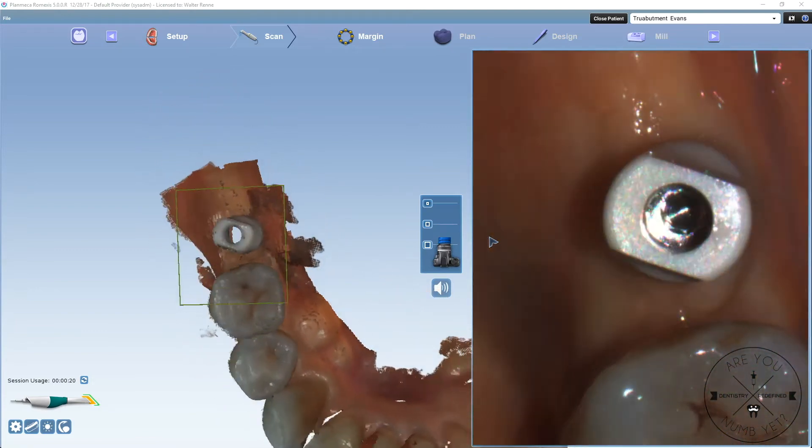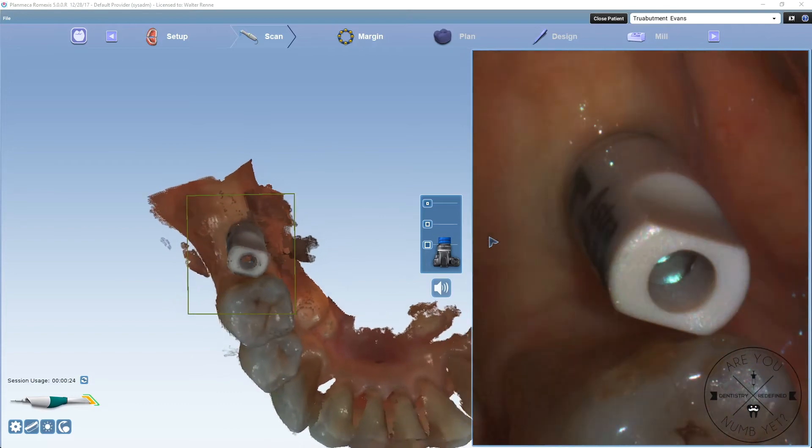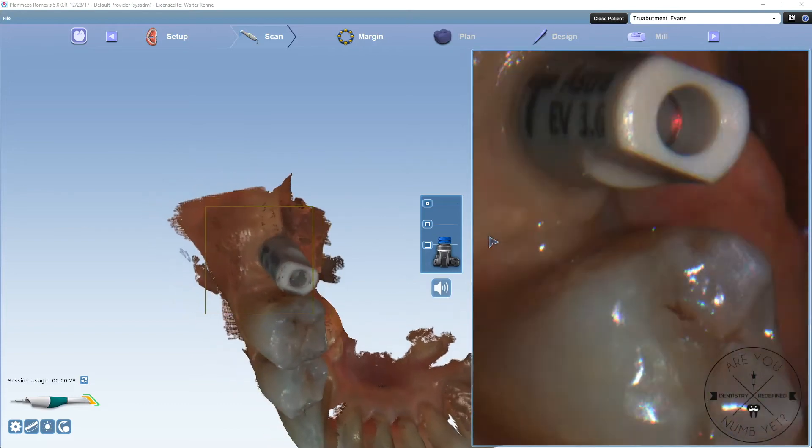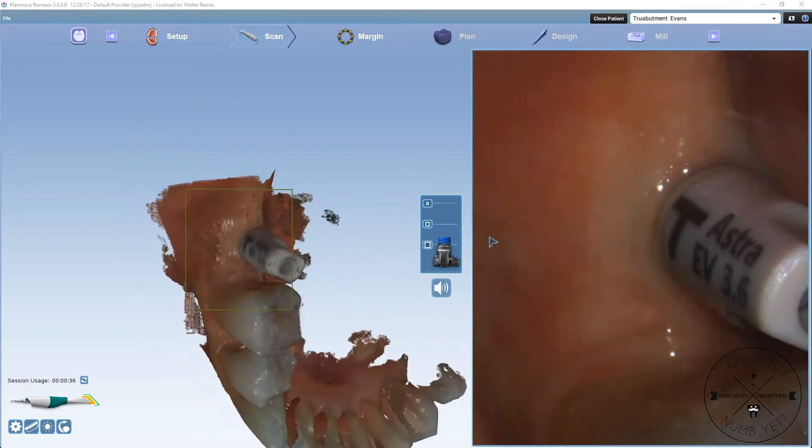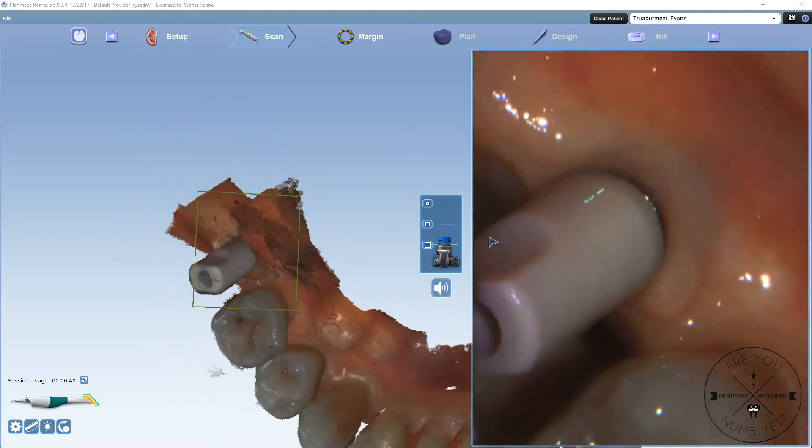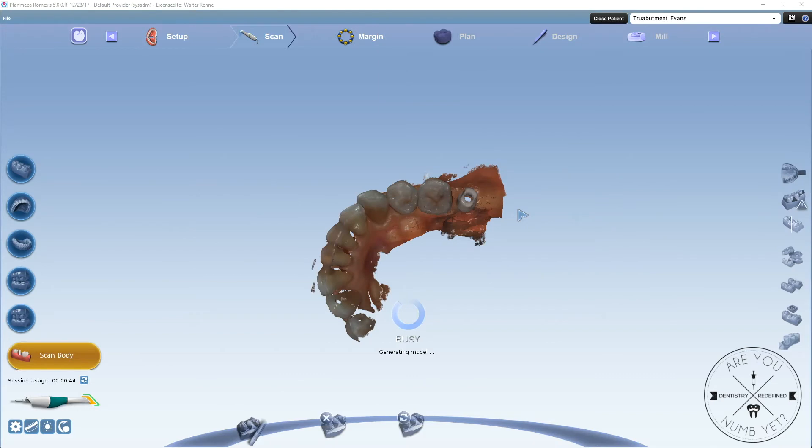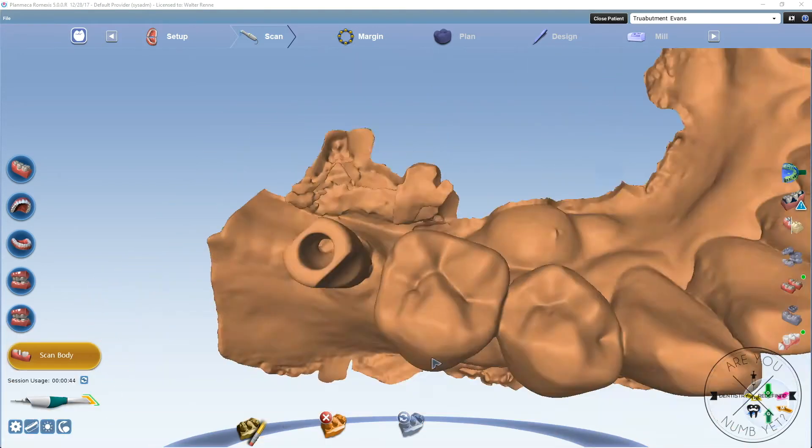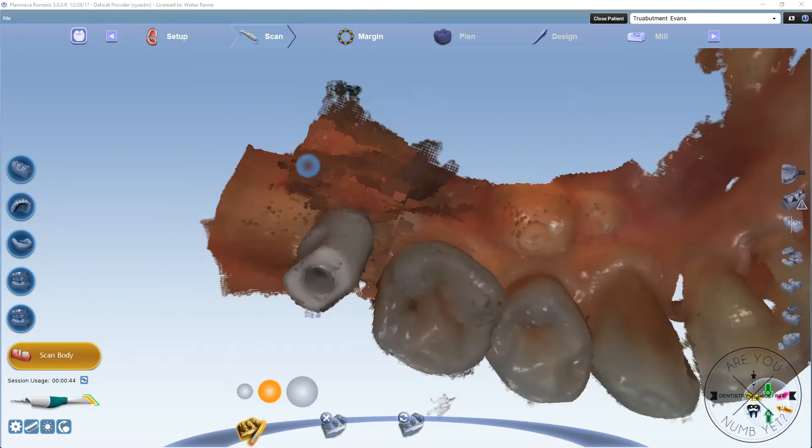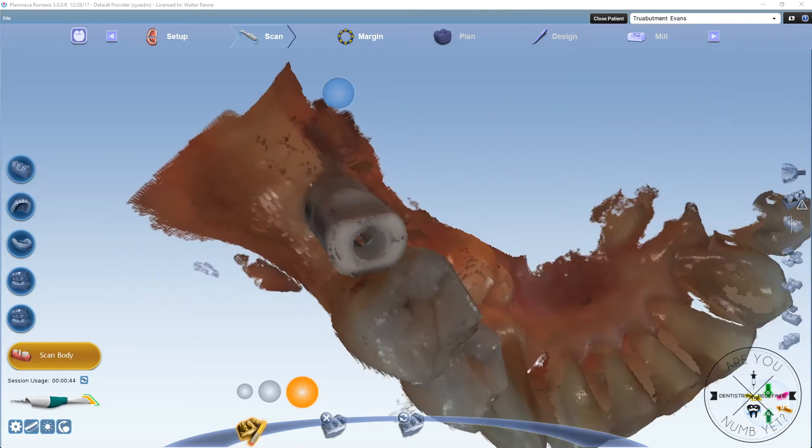Then you're going to screw in the True Abutment scan body that you have to order through them. They're reusable, autoclavable. You're going to take a check shot to make sure that's seated, and then you're going to scan that in.